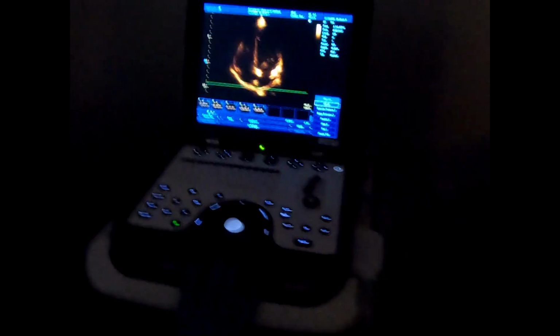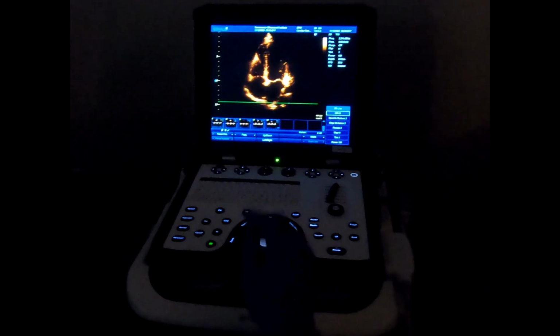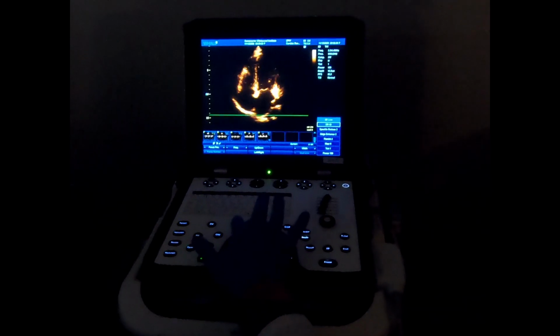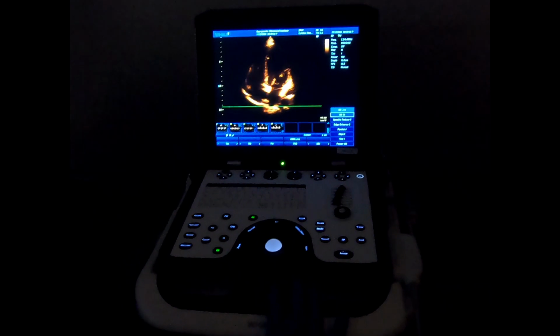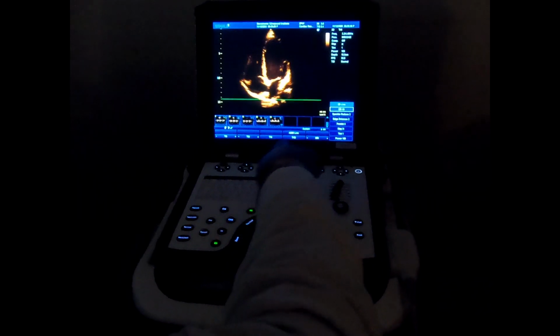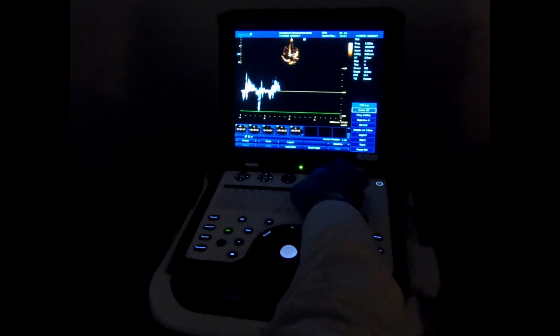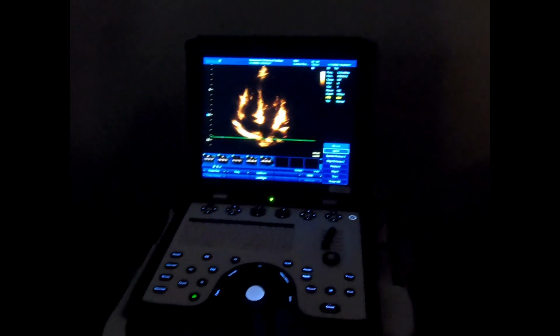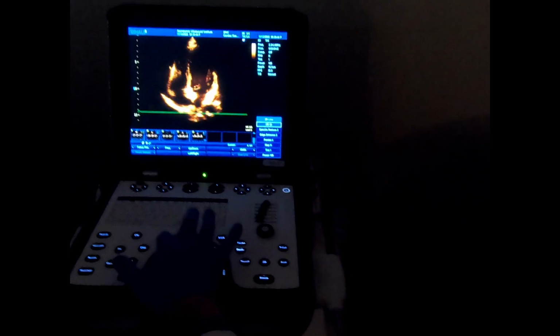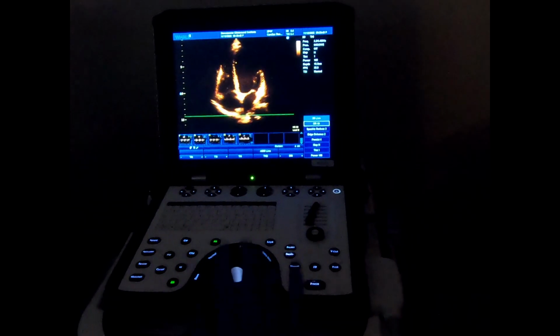For TDI, you need to combine multiple keys. What are those keys? There is Alt. Press this one first, and then you will get TVD, TVI, all of those. Sorry, what did you press? Alt, like alternate. It's on top of the trackball. Oh, Alt. Okay.